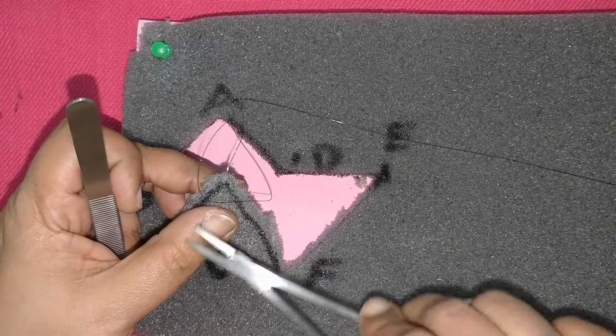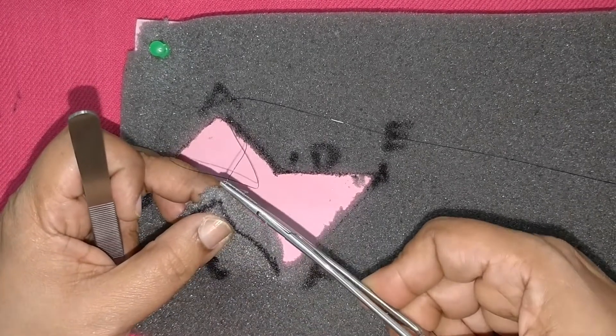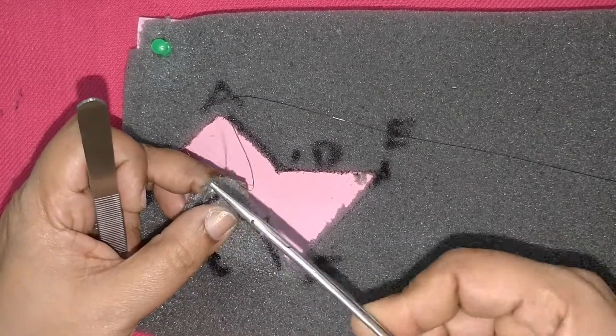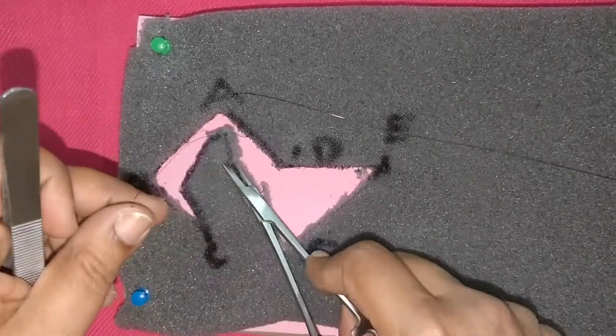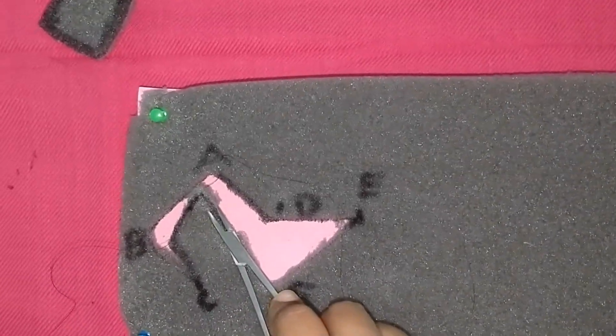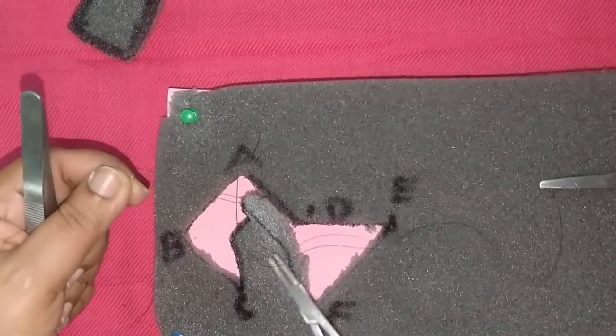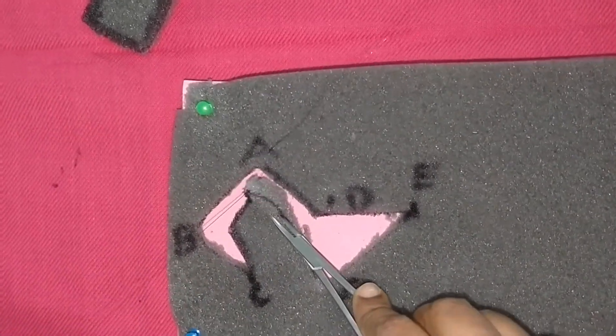Here the suturing is done first to the leading edge. The point A is sometimes known as the promontory of the defect. It represents the maximum length the flap has to reach.